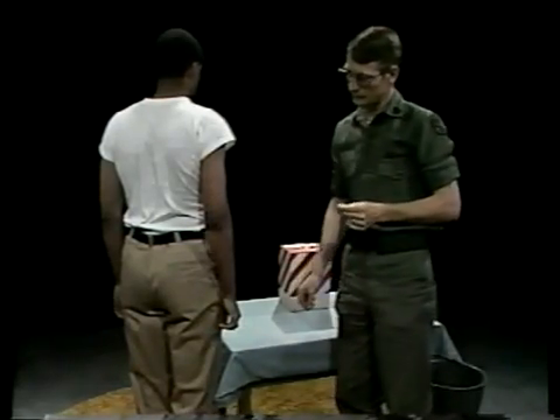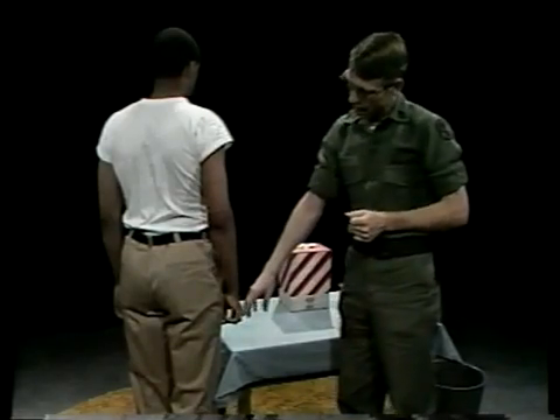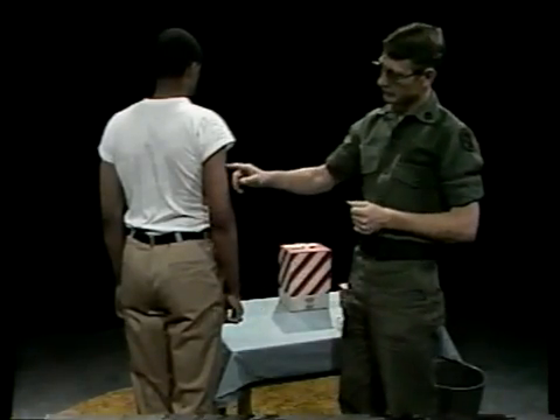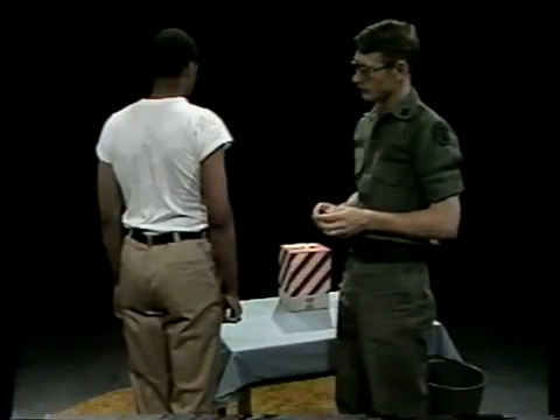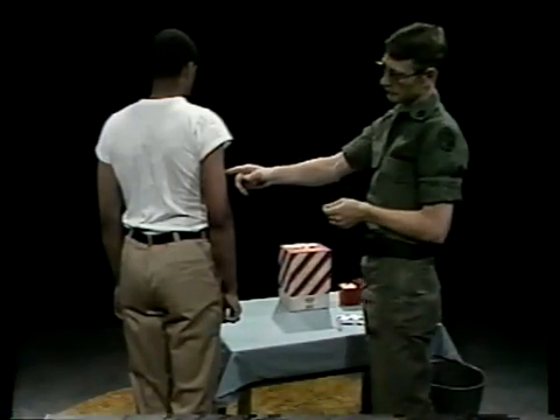Actually there are many suitable injection sites. The most commonly selected are the outer part of the thigh and the upper arm. During this program, we'll use the posterior area of the upper arm, here toward the back of the patient's arm.